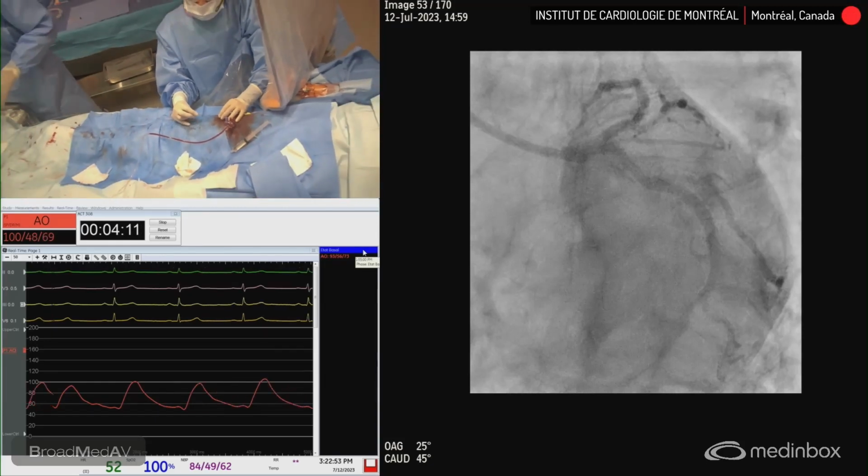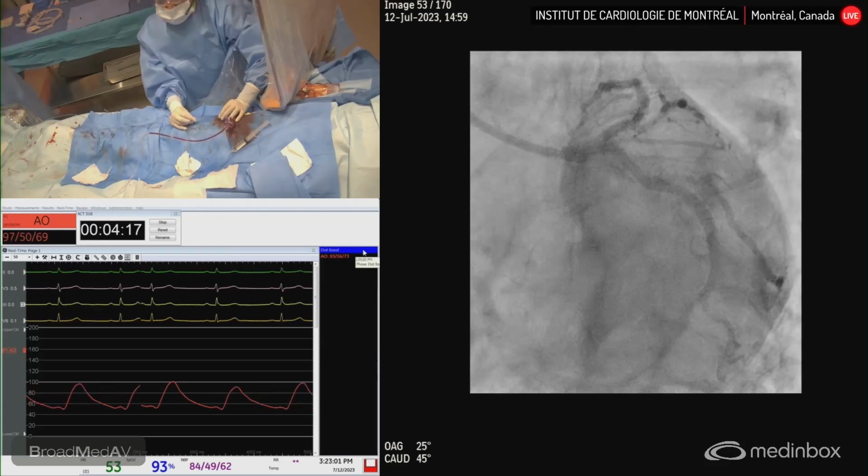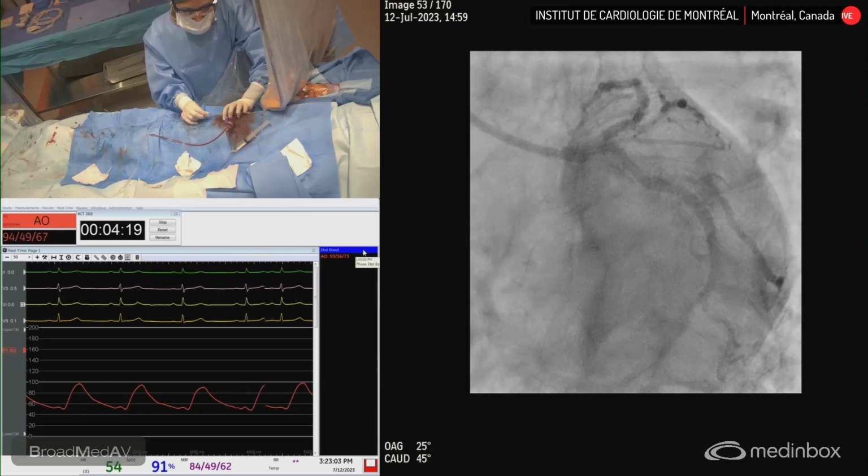Okay, c'est bon dans le vide. Ouais. Parfait, merci. Go in on scopy.